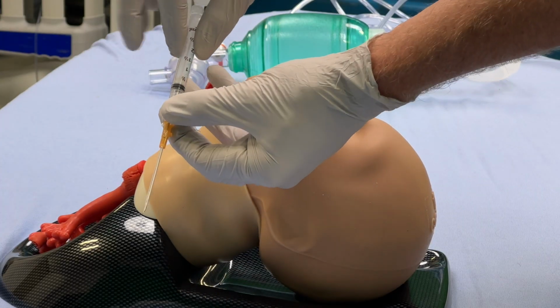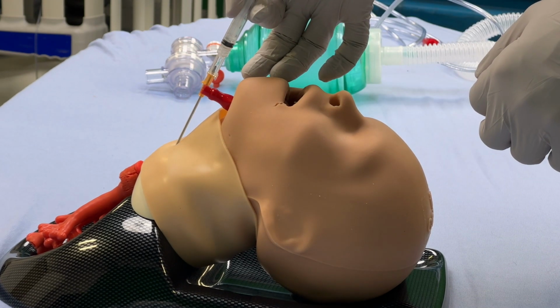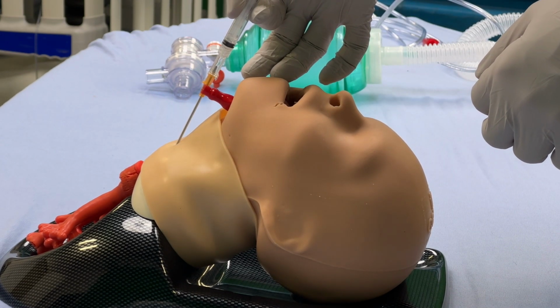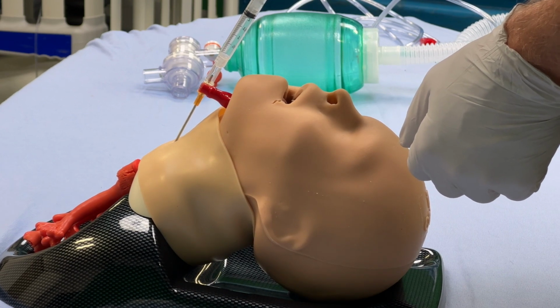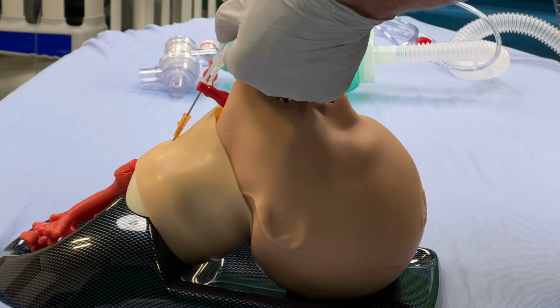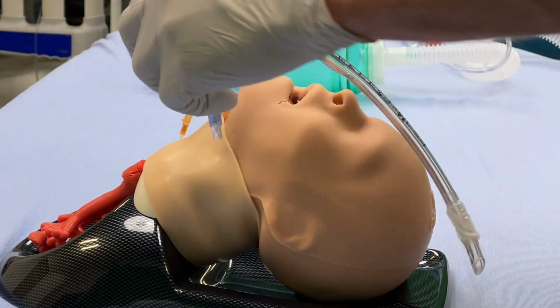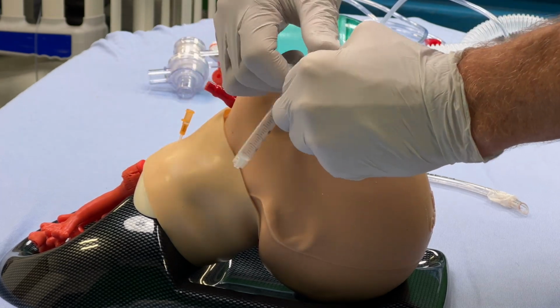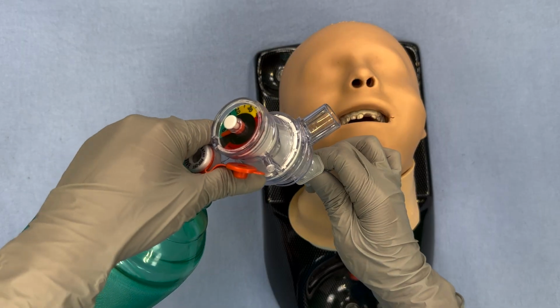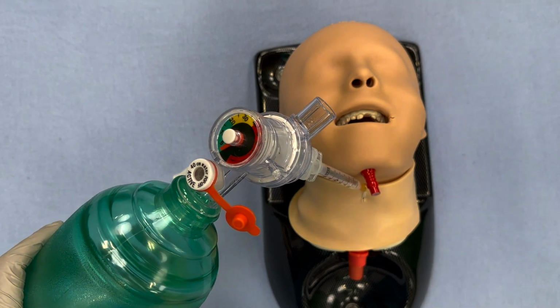Next, I'll attach a 14-gauge catheter over a needle to the syringe and place it at about 30 to 45 degrees, aiming towards the feet, and I'll aspirate as I advance. Once I aspirate air, I know I'm in the trachea. Then I'll connect the catheter to my chosen setup, aka the 3-0 ET tube adapter directly to the catheter, or the 7-0 and the 3 ml syringe to the catheter, and finally attaching to the resuscitation bag. Now that I've bought myself some time, I can take a deep breath and figure out how to get a more definitive airway.